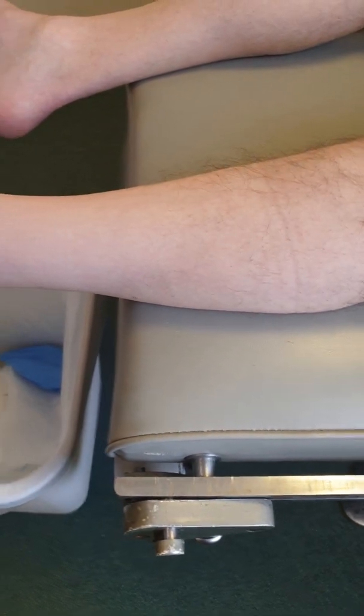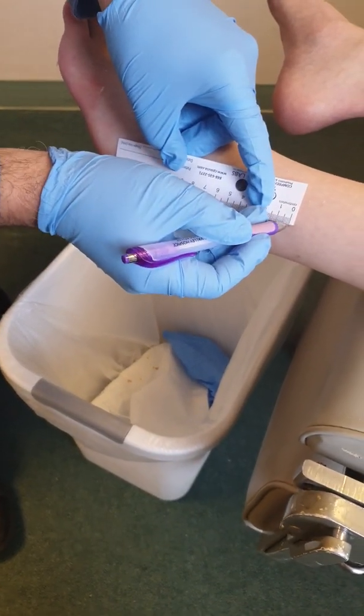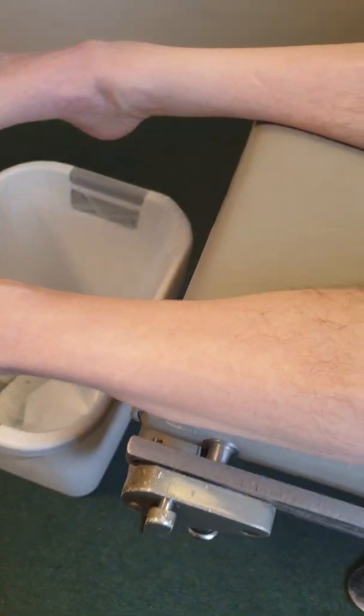What we're going to do is measure from the tip of the malleolus upward — the lateral malleolus upward to this point — 10 centimeters. We're going to do a mark, and we're going to do the same thing here.